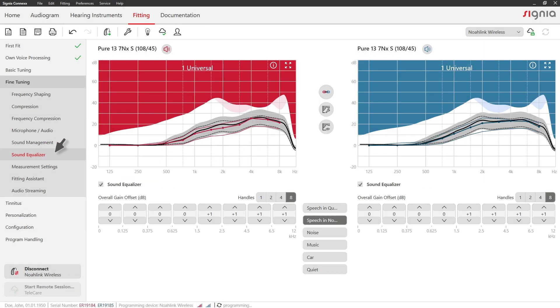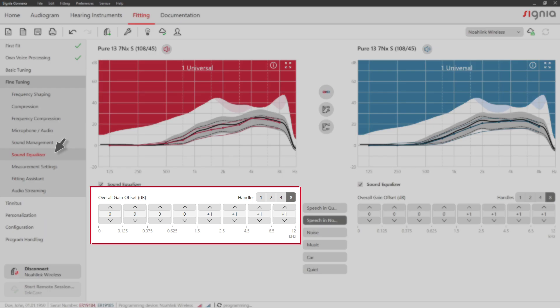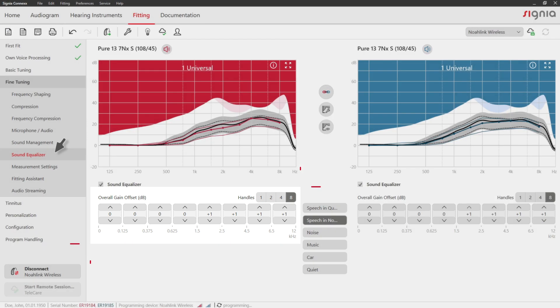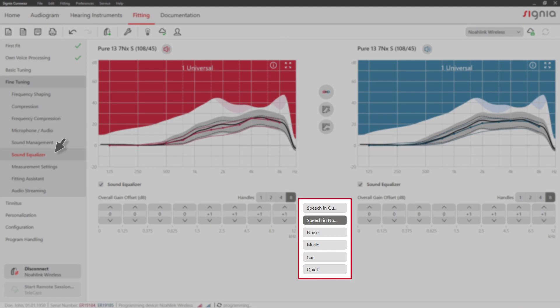The Sound Equalizer tab lets you adjust gain offsets which will then be applied automatically in the Universal program for specific situations.